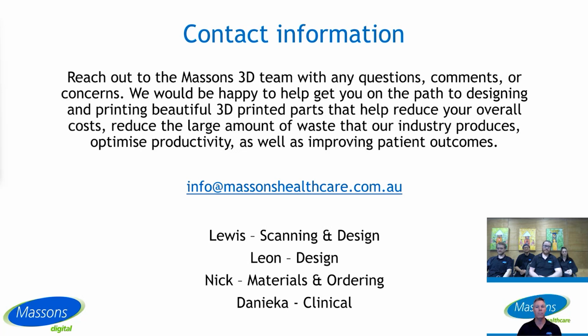The benefit of the foot station module is that it's more or less like a box that the person puts their foot on top of, and it's got a mirror within it and markers so that the software knows where the mirror is in relation to the foot. So instead of having to go under the plate, which is what you'd have to do with your current scanner, they can just stand with their foot on the ground and you point down.